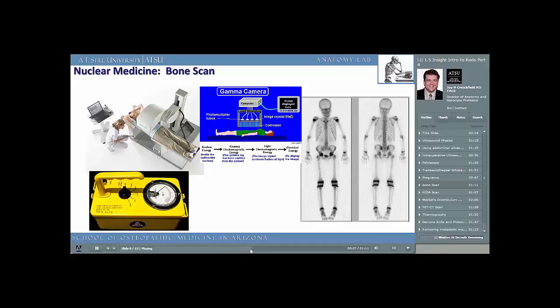The most important aspect of interpreting an image from a bone scan is to look for symmetry. If there are any abnormally generated areas of high intensity, shown by the black marks, that may be unilateral on one side, these raise suspicion for underlying disease such as metastatic cancer, trauma, fractures, even arthritis. This patient has symmetric lesions, and his findings are most consistent with a normal bone scan, probably with arthritis in each of the respective joints.